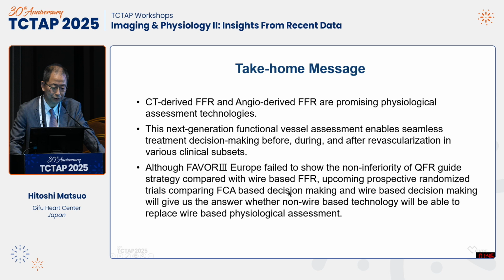So the take-home message is here. CT-derived FFR and angio-derived FFR are promising physiological assessment technologies. This next-generation functional vessel assessment enables seamless treatment decision-making before, during, and after revascularization in various clinical subsets.